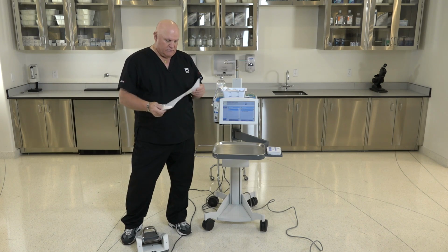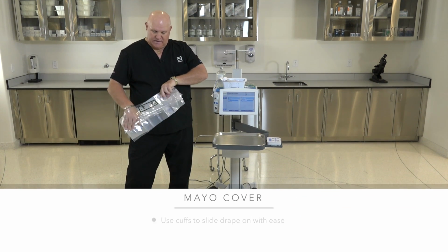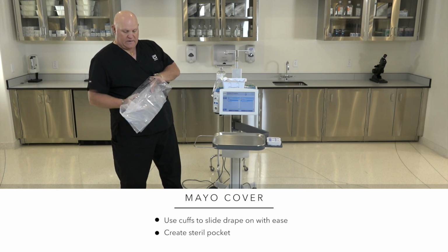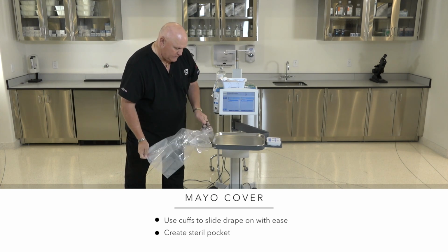First thing is to place your sterile drape on the Mayo cover, being careful to place the hands as instructed, right hand under the right cuff and left hand under, and then slide your drape onto your Mayo cover or your Mayo tray.